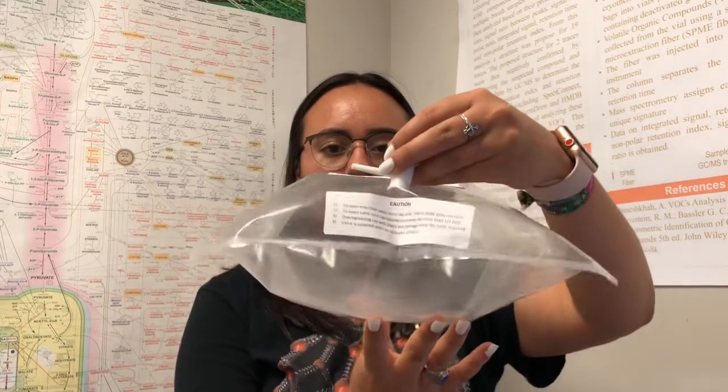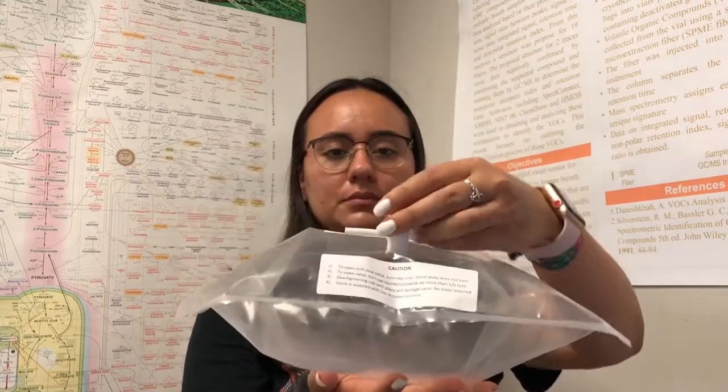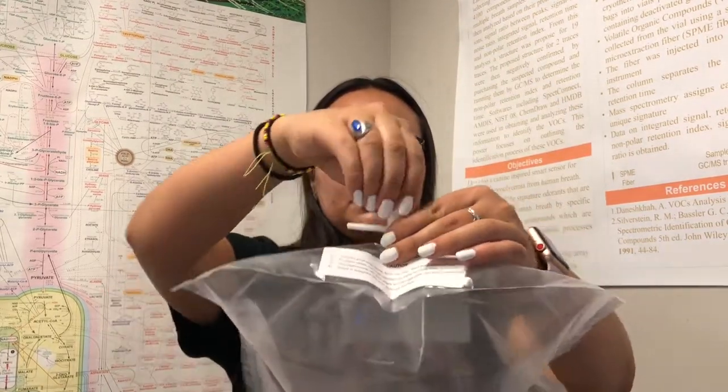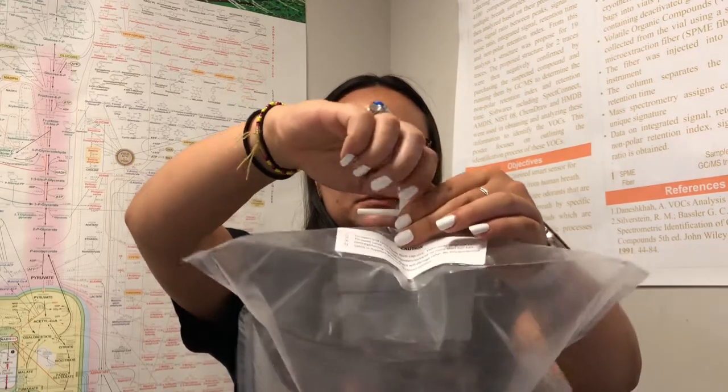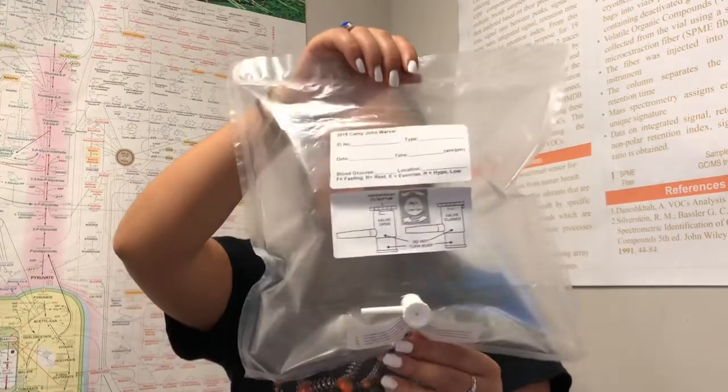Once the bag is 80% full, close the valve by turning the top all the way to the right clockwise. The sample is ready to be collected.